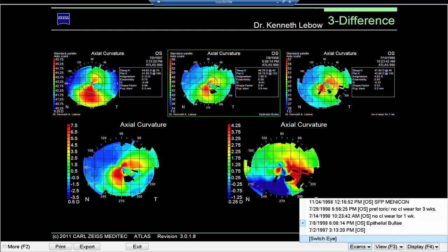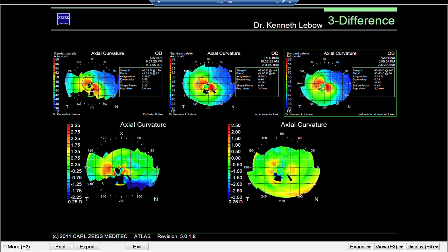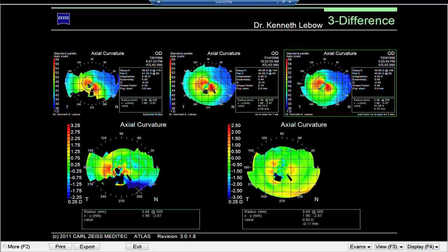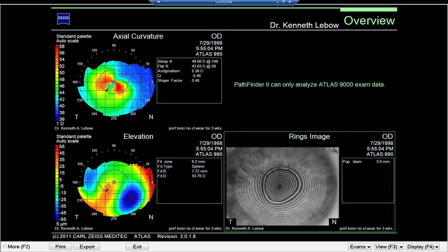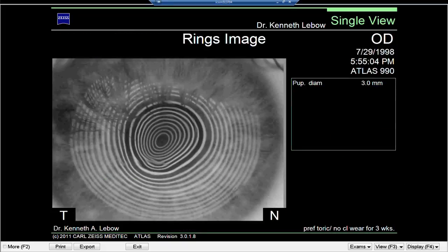Switching to the right eye: the first image shows some keratoconus, then dealing with the Muro Drops, one-week difference, and three weeks difference because I treated the patient for three weeks with Muro Drops. You can see the pattern recognition is keratoconic and there's still some steepening going on. Looking at the overview, there's a very, very distinct pattern of keratoconic development, and looking at the ring image, you can see how it's distorted, creating a keratoconic eye.